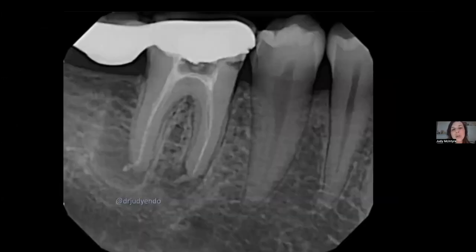And because I now know the information, I can adequately have a treatment plan. I can be confident in a treatment plan to share with her. I can say, yes, I can retreat this. This is not fractured. And sure enough, we do. So I go in and this entire bridge was grossly decayed. I bypassed the separated instrument and I medicated.